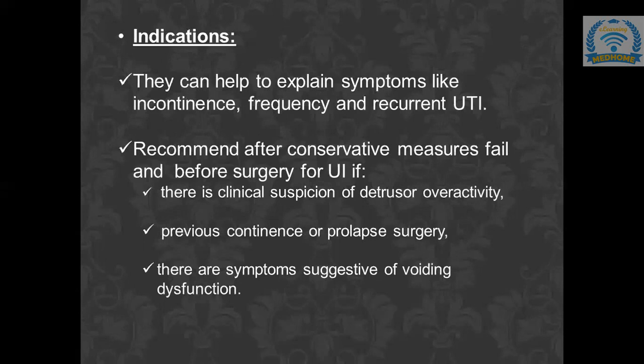Now, in terms of indications, first of all, we have incontinence. According to the type of incontinence, we will be dealing with conservative management. If that conservative management fails, or the patient has had any previous surgery for incontinence or a prolapse surgery, and she has again come back with symptoms of incontinence, or she is still having them, we have a high suspicion that she is having detrusor overactivity. So these are the indications in which we will do urodynamics.